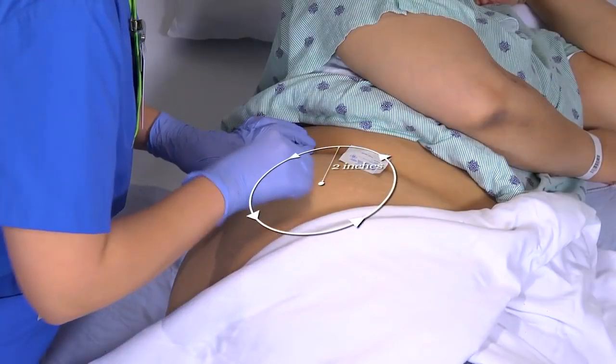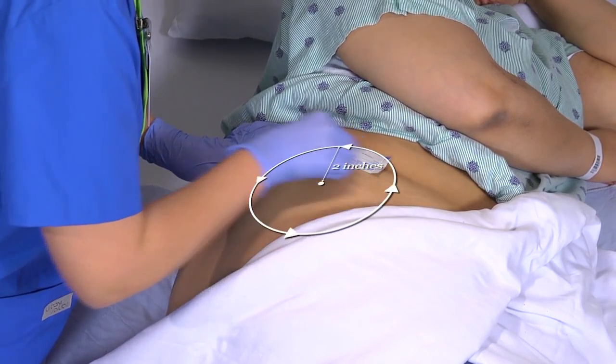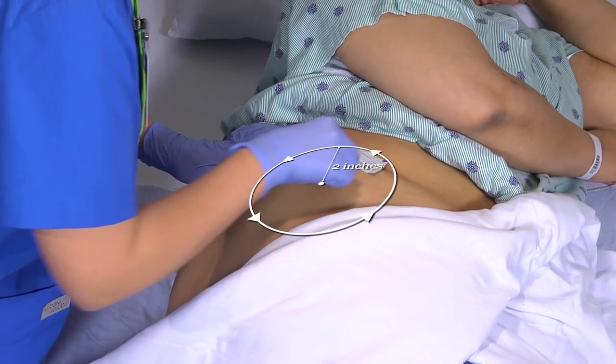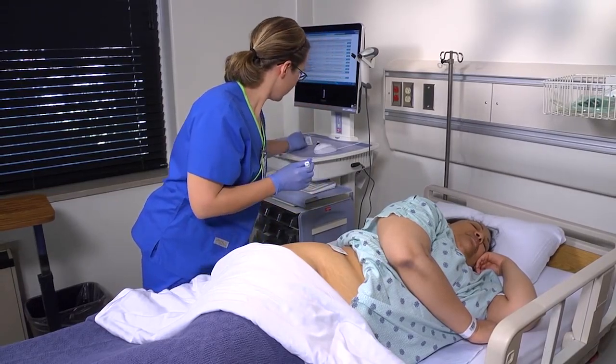To clean the injection site, begin at the center and move outward at least 5 centimeters or 2 inches in a circular pattern. You might want to apply an anesthetic cream, such as EMLA, to the planned injection site about 1 hour before you administer the injection. Or if you use a vapocoolant spray, such as ethyl chloride, spray it on the site just before giving the injection. Hold a gauze pad between the third and fourth fingers of your non-dominant hand and remove the needle cap or sheath by pulling it straight off.